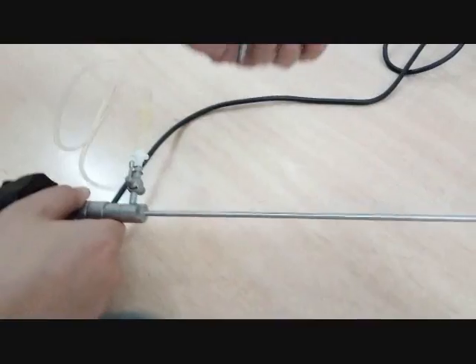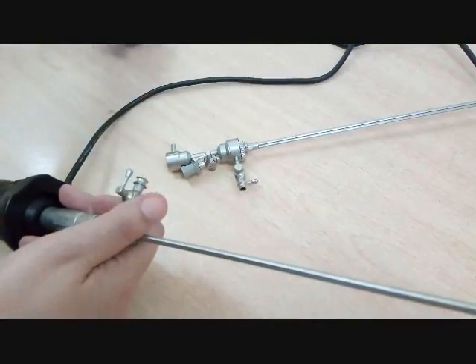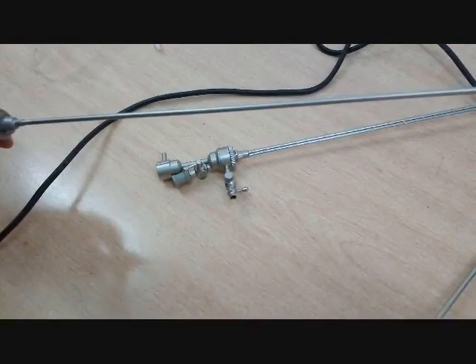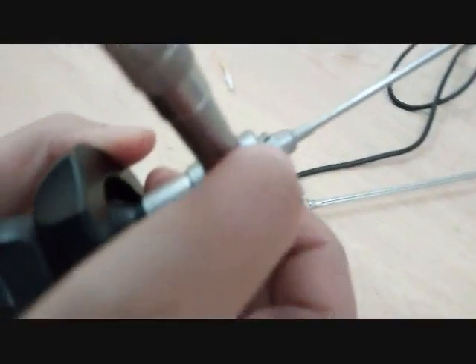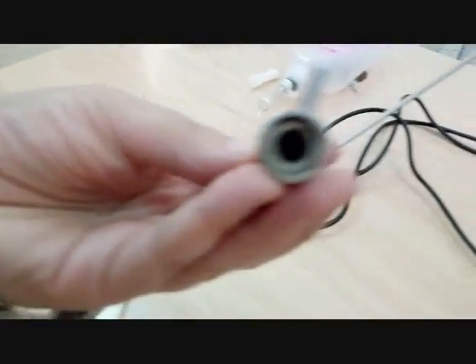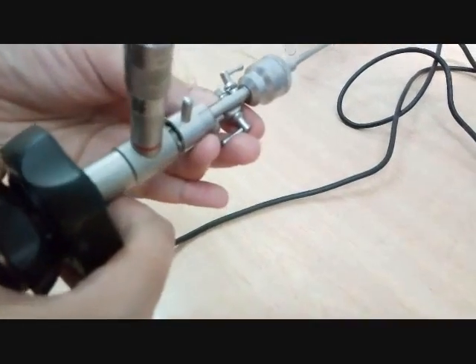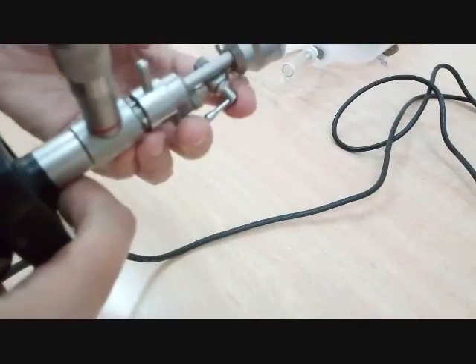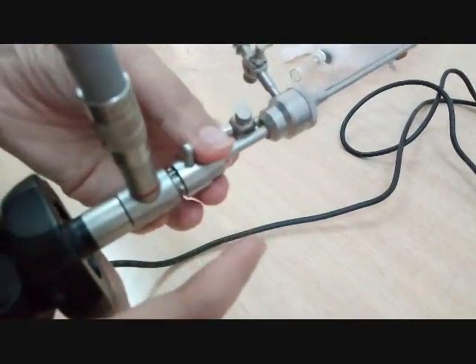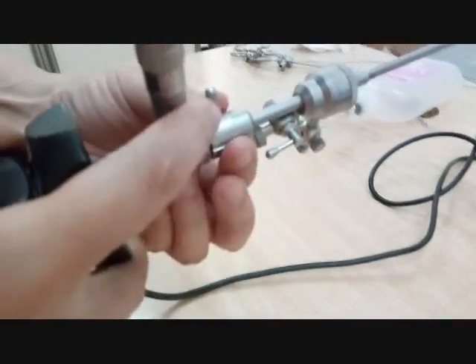So we want to assemble it with the scope, but first we have to take off the diagnostic sheath. We took off here the irrigation tube, we unlock, and we take off the diagnostic sheath. We replace it with an operating sheath. See the notch here? There's the notch in the scope. We want to put the bump of the operating sheath. Here's the little bump here. We put it against the notch. See, it doesn't assemble, it doesn't work. Why? Because the streaks are not aligned. See? We always must align the streaks. Now they are aligned. We put the bump against the notch and we assemble and lock. See?